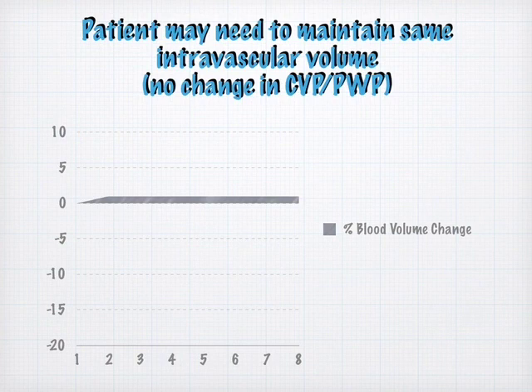So in all honesty, I felt like this was most often what my situation was in critical care, because in critical care, my patients weren't chronically fluid overloaded. They weren't chronically dry. We were very attentive, and we did the best that we could to make sure that these patients were at the preload that they needed to be at. We watched CVPs and wedges or whatever other gadgetry that we had to try to make sure we were maintaining intravascular volume. So basically what I wanted to do in critical care most of the time, if I had a preload right where I wanted it, is I wanted to remove fluid.